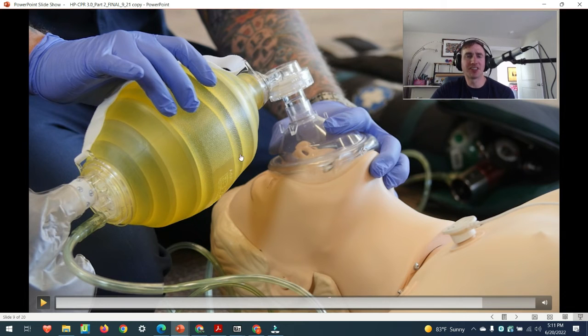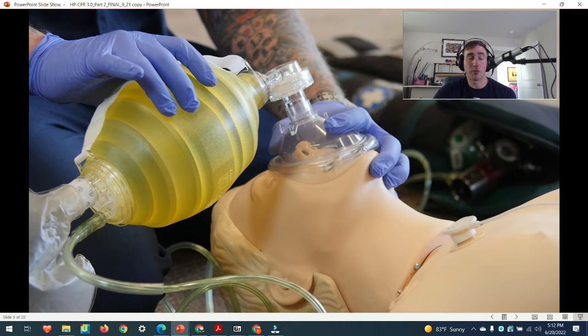So in this video, you can see what I was talking about, how you bring the BVM out to the side here to add some weight to this side of the mask. And with these fingers here, they're pulling the chin up. Now, if you're a smaller person, you might not be able to get a good seal. So you might have to have help. In fact, you might need two people with you on the airway.